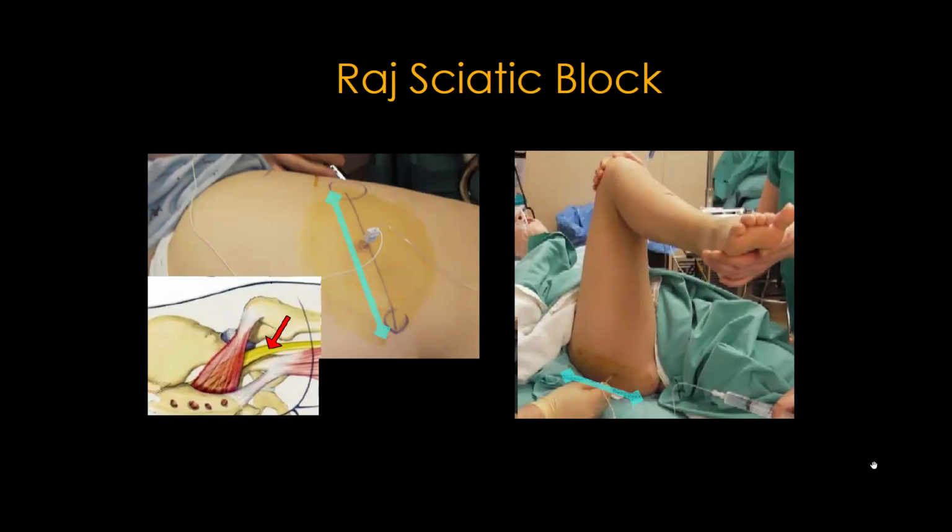If I have an 18-year-old pitcher getting elbow surgery, I might not even block them at all because I don't want any risk of paresthesias or pain, or I may do it and not be aggressive. But this one I'm going to be aggressive because I don't want to put this guy who's got a valve area at 0.6 to sleep. So this is the greater trochanter, ischial tuberosity, and right in the middle is a big old nerve. And you want to do what we call the donut sign. Donut sign means the nerve is floating.